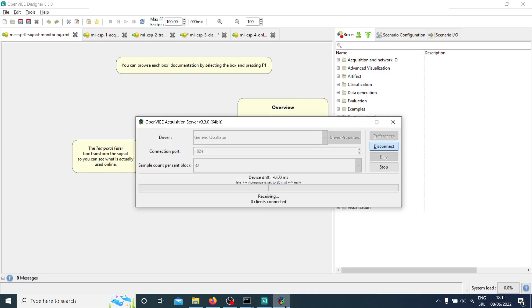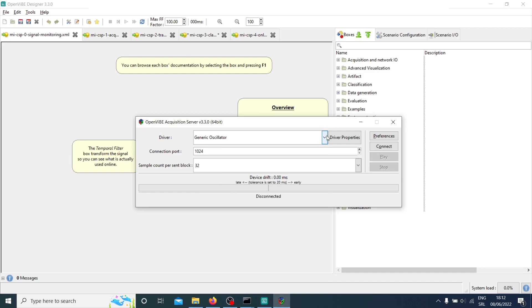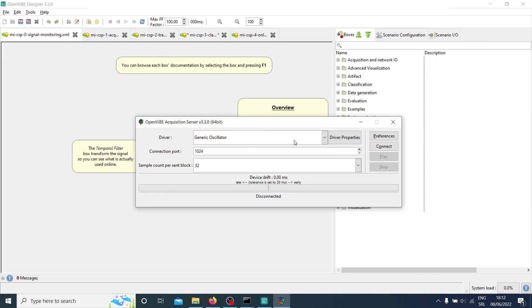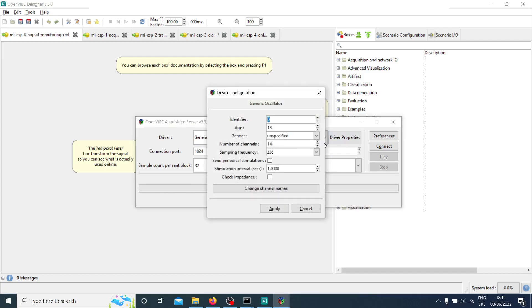So I opened the acquisition server. I'm not going to be connected to any EEG device, so I'm just going to create fake generic signals. You can choose that in the menu of the OpenVibe acquisition server. You don't need to connect to any device for the purpose of this example, so you can see how things work — basically how to save your data, which is quite easy.